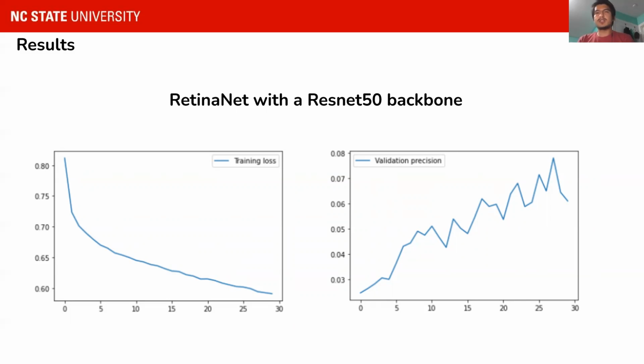And so then in conclusion, our results show that even though we were not able to get results as good as the baseline model, which was the faster RCNN with the ResNet 50 backbone, we did still achieve interesting results. We showed that the MobileNet was a lot quicker to train. This is due to the way that the model is defined. It uses separable depthwise convolution. We also showed that the single shot detection frameworks are a lot quicker than the two-stage detection frameworks, even though the results were not as good.